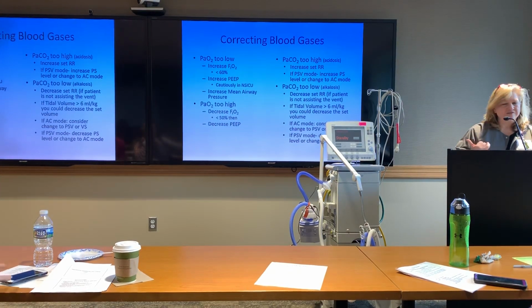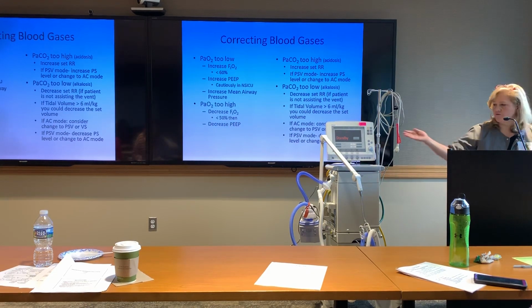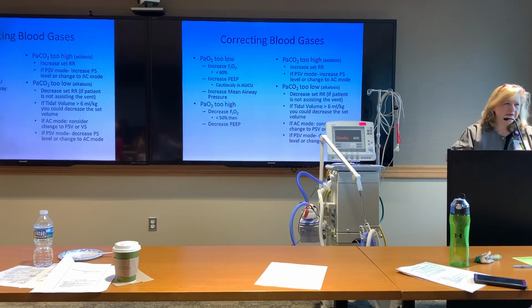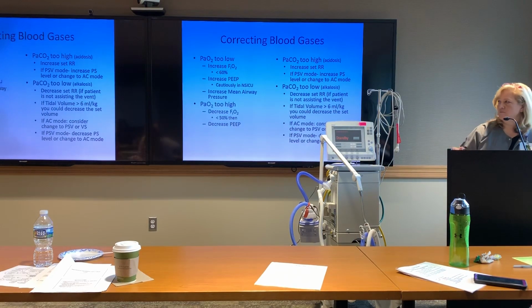When you do get a vent change from a doctor based on the blood gas, make sure that he's giving you a number that makes sense. If we're on a rate of 15, he says we'll turn it over to 20, but the patient's been breathing 22, that's not going to do any good. You've got to go over what the total rate was in order to make a change on that.